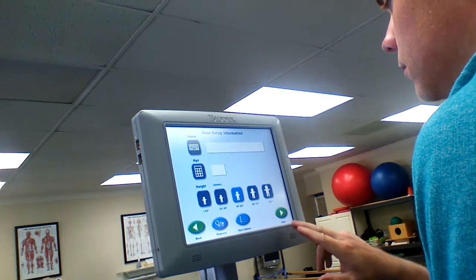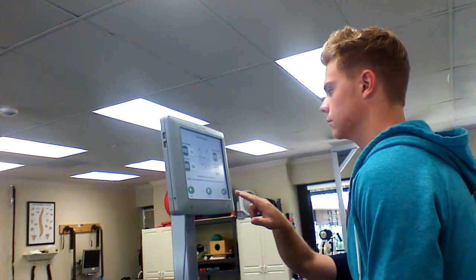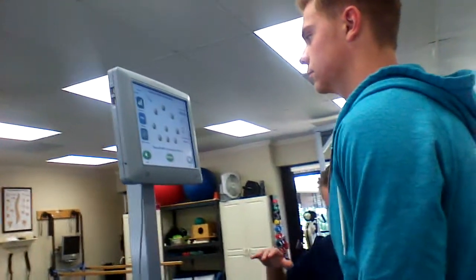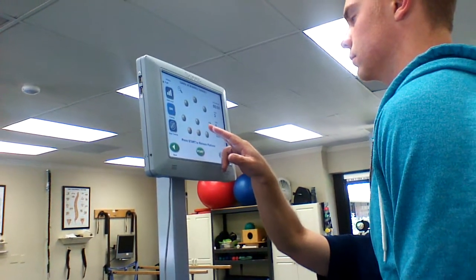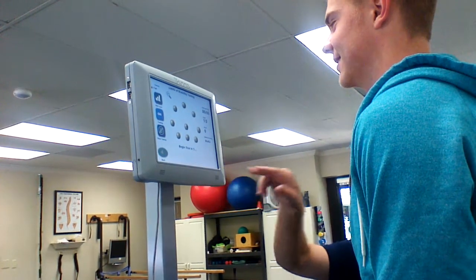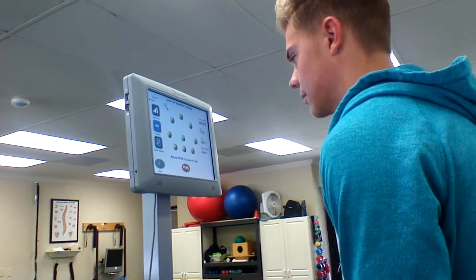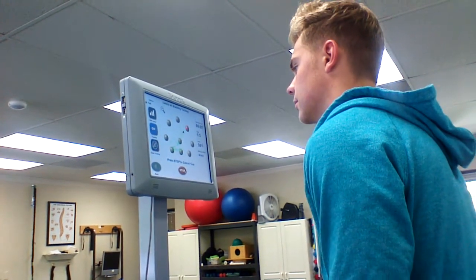I'm not going to fill that in because that doesn't really change. Go ahead and let go. Pretty comfortable in the middle there. So when I hit start, the platform is going to stay stable in this case, but you're going to try to make your dot go to the ball that is flashing. I'm going to hit this. Get yours in the middle — you're always kind of off to your right a little bit. About right there. And then you'll see this one flash, so go to that one. Stay there for a half second, then come back.